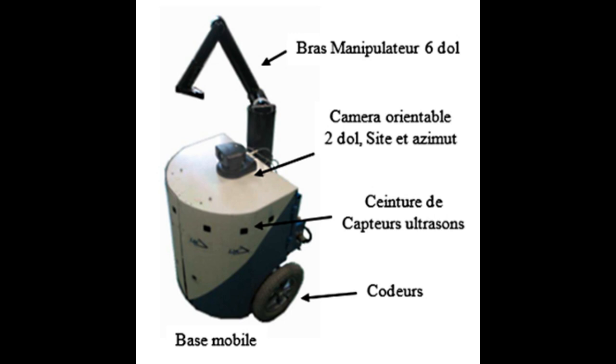The first is to reduce the complexity of the machine by taking advantage of the person's perception and decision-making skills. The second is to maintain natural active rehabilitation by involving the person as much as possible in the task. The scientific problem is part of a field of research known as computer-assisted teleoperation, CAT.